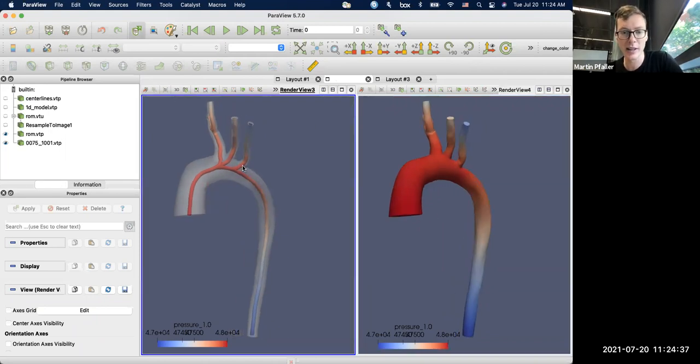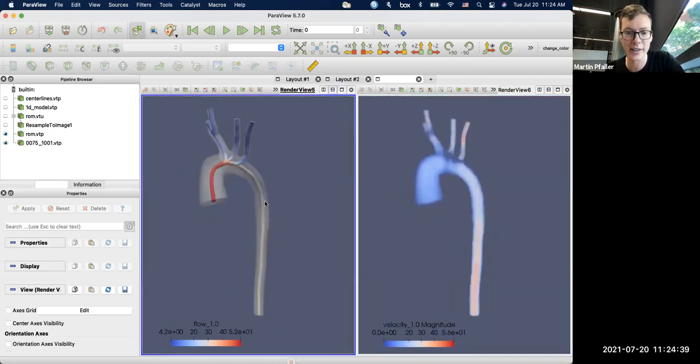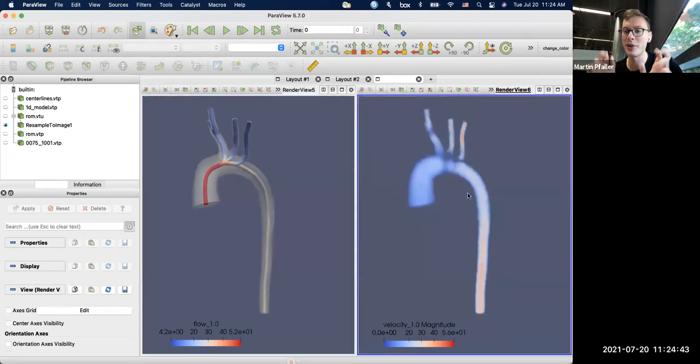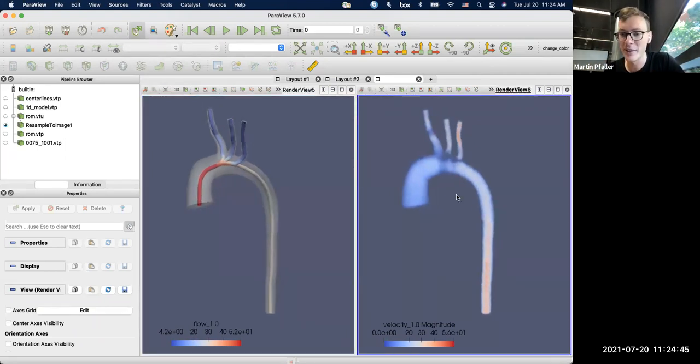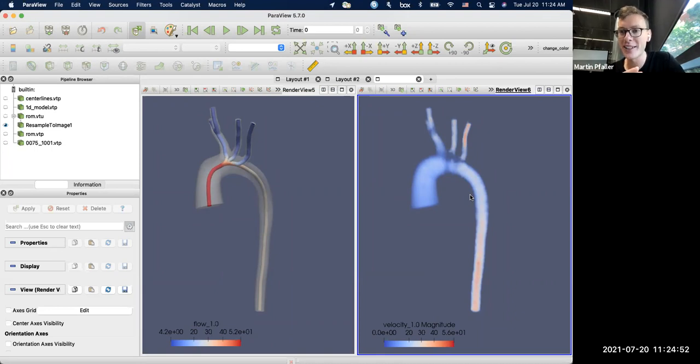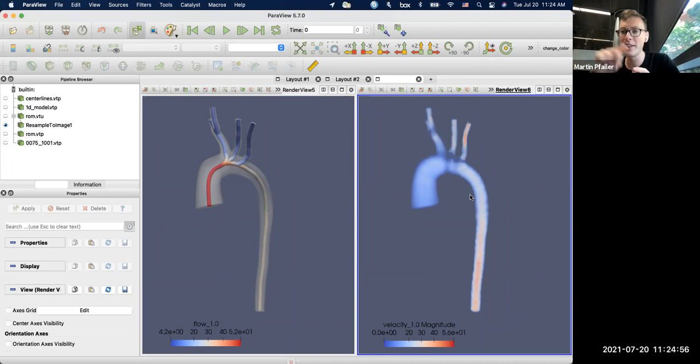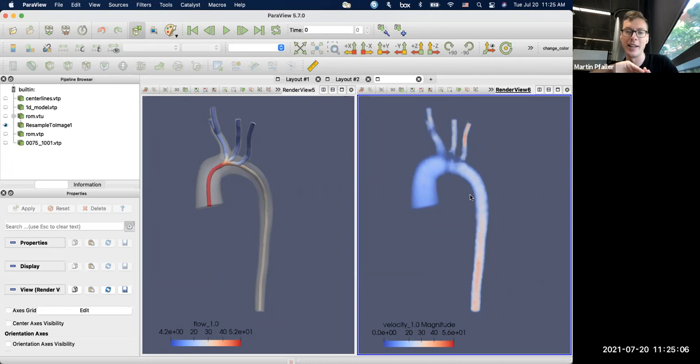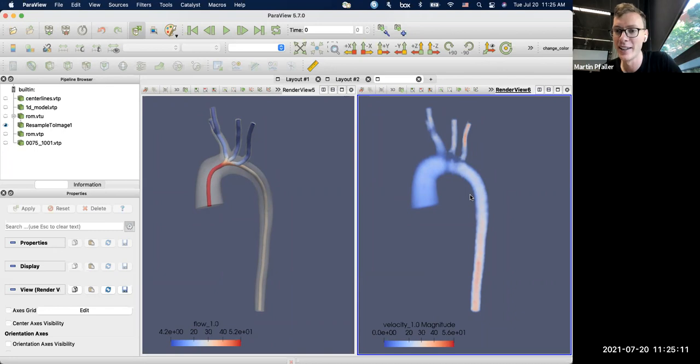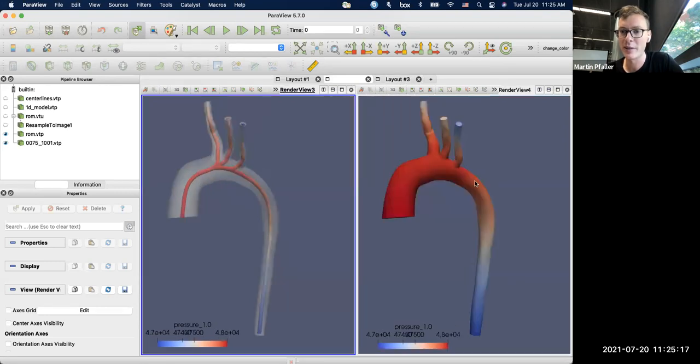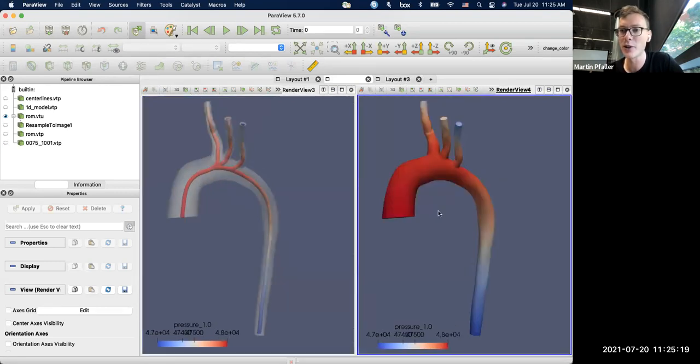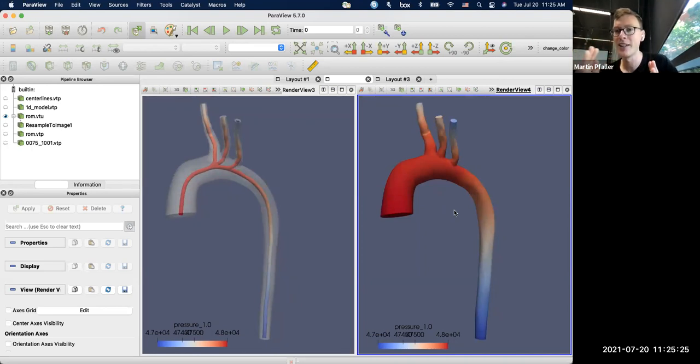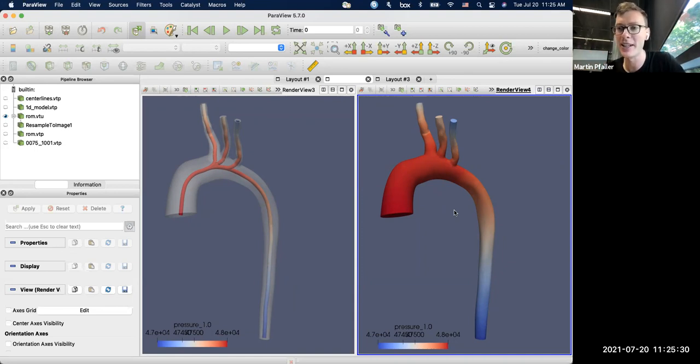So you can either use that for visualization or Jonathan and I recently published a paper where you can use those projected 1D or 0D results as initial conditions for your 3D results. And so we not only project the pressure, but we also project the flow onto the centerline. And from that we extrapolate a velocity field that you can see here on the right. So that's the 3D velocity field. Of course, that's a very rough projection. It will preserve the quantity of flow in each of the branches and will assume a quadratic flow profile. But of course it doesn't strictly enforce boundary conditions.